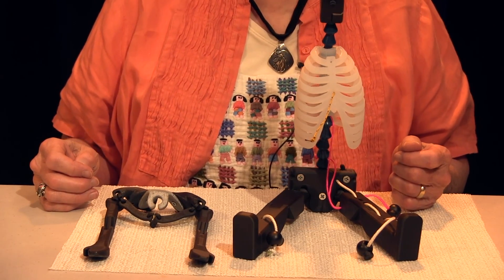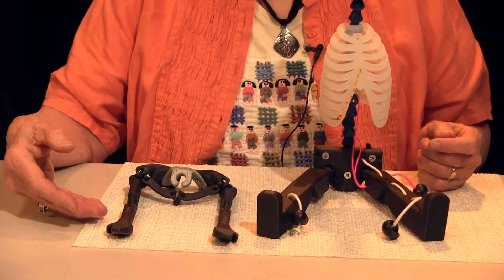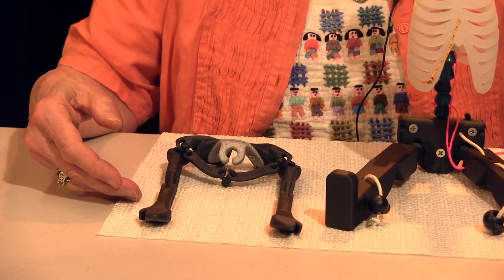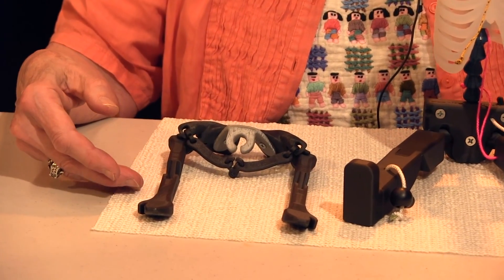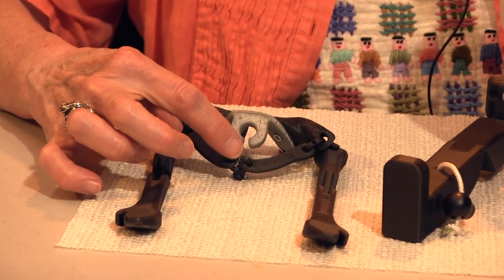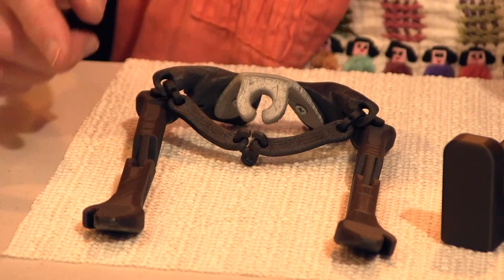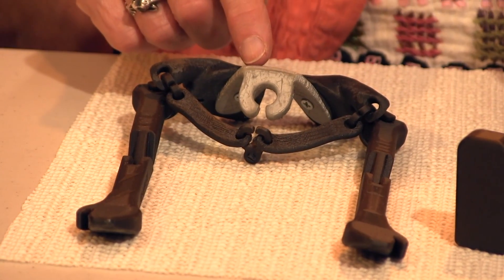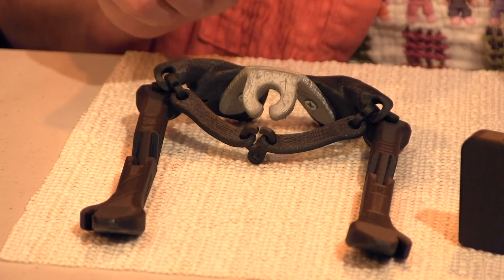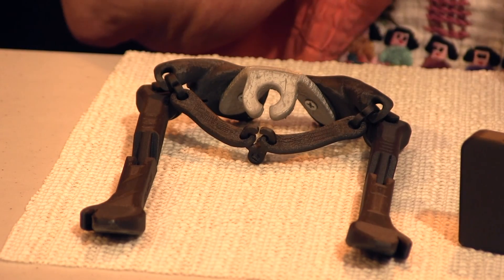With HAMI's chest in place, we can now add his shoulder girdle and arms. These are designed to be removable with movement potential to demonstrate upper limb impact on sitting and lying posture. The sternoclavicular joint is the only bony joint attaching the shoulder girdle to the rest of the body. A rear clip simulates all of the muscles attaching the shoulder girdle posteriorly while allowing complex movement patterns. The clip also secures the unit to HAMI.